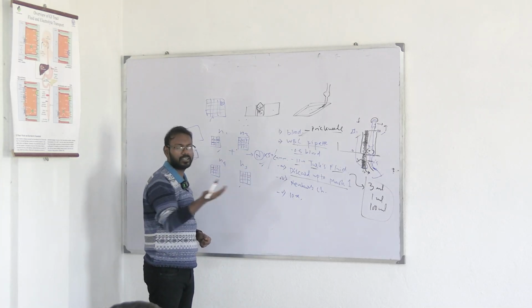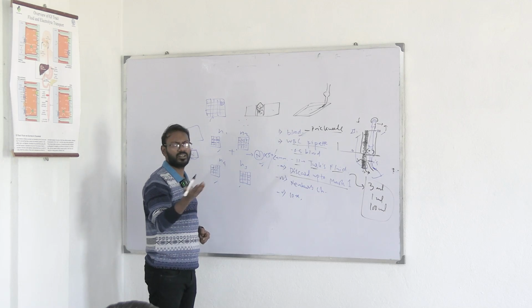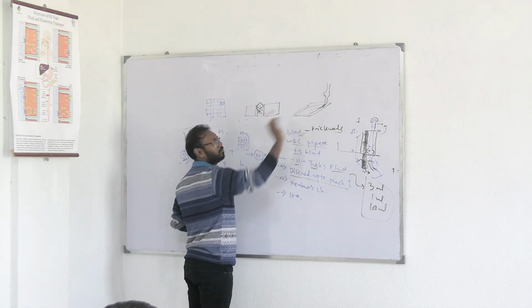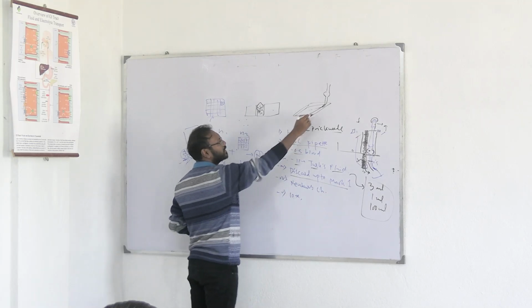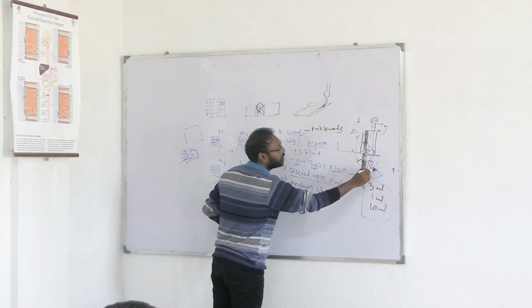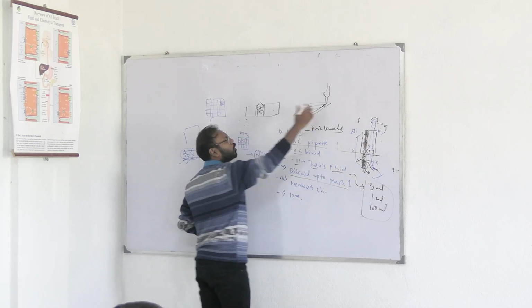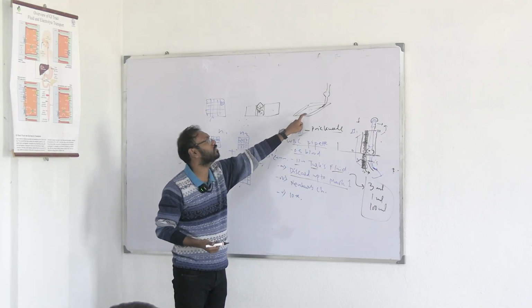Okay, the view can be hazy or improper, it won't be right. So just let the chamber be like that. The cover slip will stay as it is. Just put the tip of your WBC pipette over here. Automatically fluid will be sucked into the area below the cover slip.